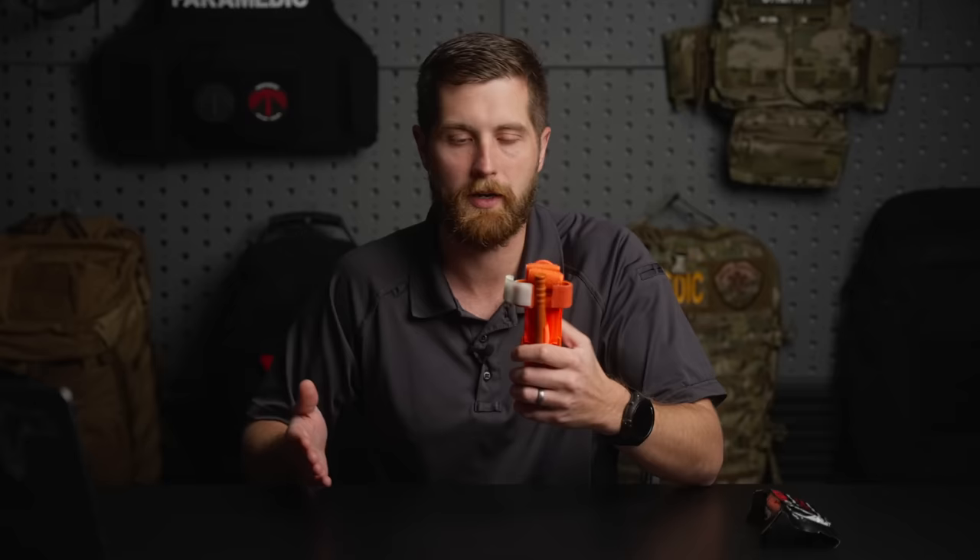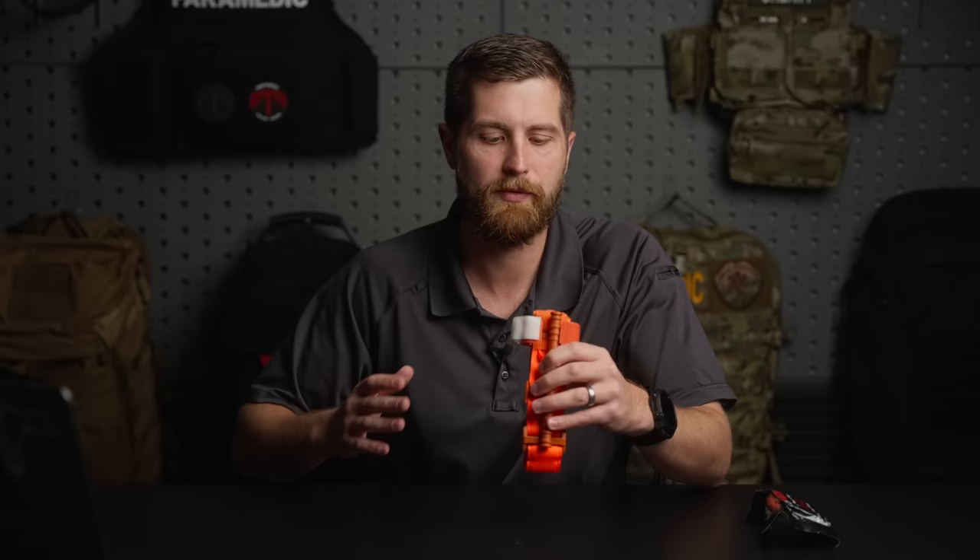Number two: a tourniquet of some kind. I like the CAT tourniquet because it's what I've been trained on — it's a solid piece of equipment. The Committee for Tactical Combat Casualty Care has recommended a pretty big list now, so go check out what some options are. I like the orange color for civilian use because you're probably not getting shot at — you don't need a low-profile color. The orange is just really noticeable when they roll into the emergency department.